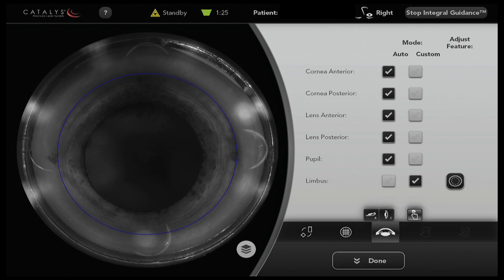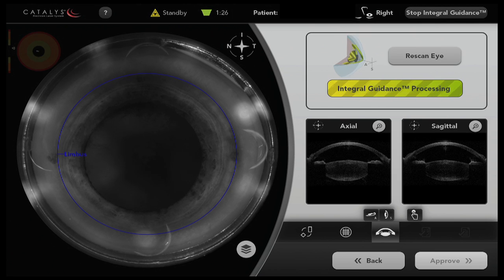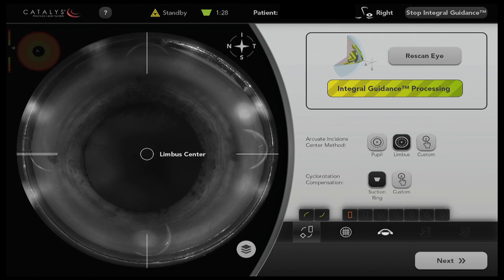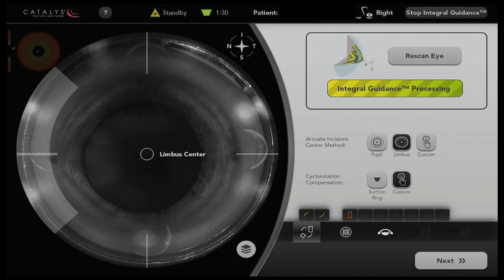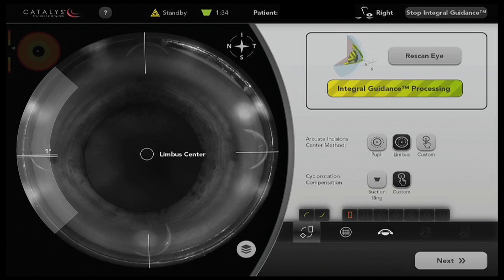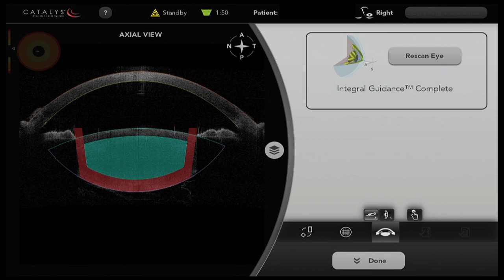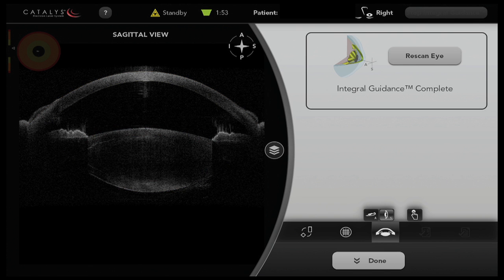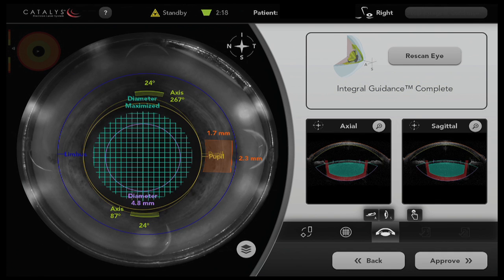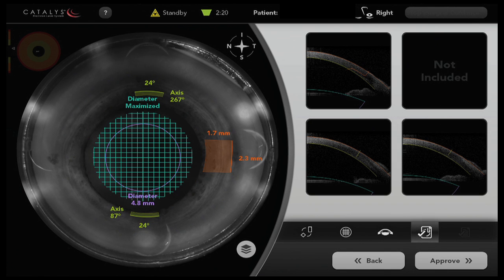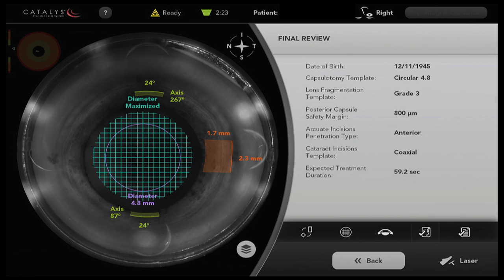The overall surgical plan is demonstrated and here we're acquiring data. At this point in the process I'm adjusting for cyclotorsion using pre-placed marks of the corneal limbus. The treatment and safety zone are observed and the treatment plan is then verified.